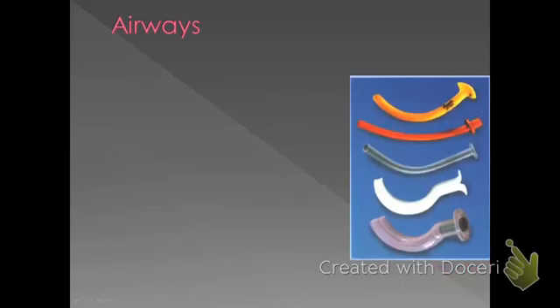So this online lecture will represent Chapter 7 in your textbook entitled Airway. I think as a first responder, I've taught you the steps of opening the airway and assessing the airway, but after you do that, you also need to realize that there will be devices that you will have to use to assist you in your artificial ventilations for your patient.